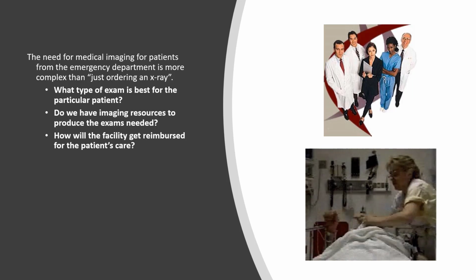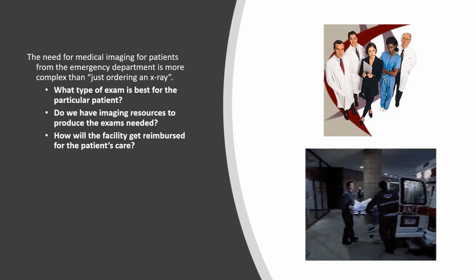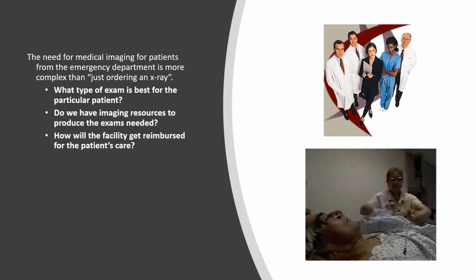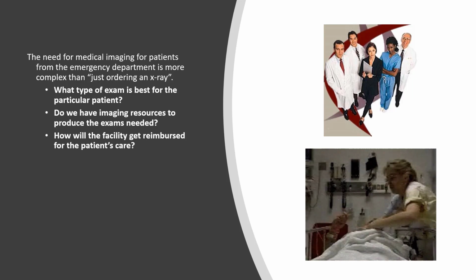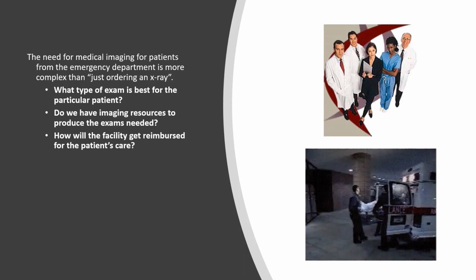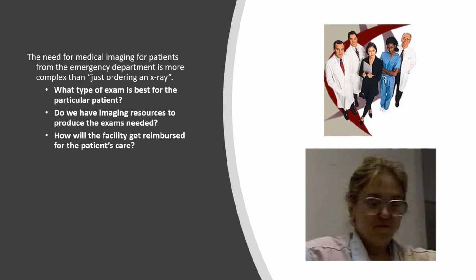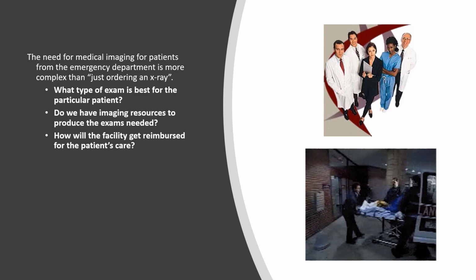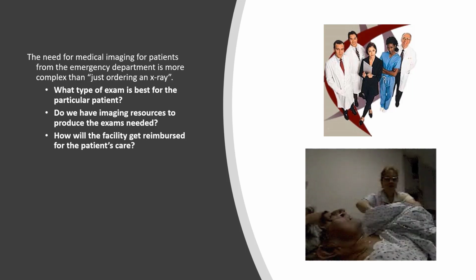For the radiographer, what we have to look at is our request. Was the request filled out correctly? The right patient, etc. All the demographics. Did the request have the information that would help the radiologist or interpreting physician in diagnosing the examination or the image? How many times have you gotten an x-ray image request that says x-ray for pain? Well, that doesn't do a whole lot, does it? Or how many times have you got a request that says x-ray the right knee, and you take a look and it's the left knee?